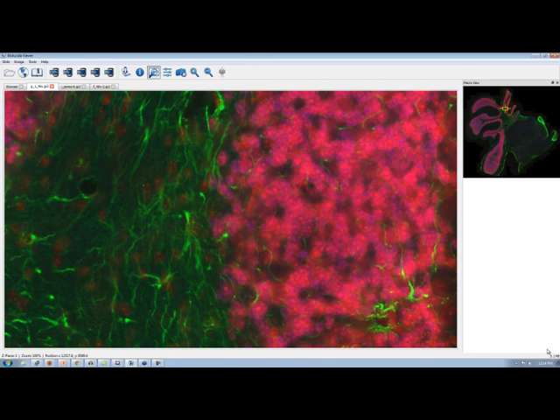Sure. Now this image itself is a 2D virtual slide. It's about 30,000 pixels wide by 30,000 pixels tall, and we're navigating around pretty quickly for it. Yeah, absolutely. Compare this to a standard single image capture. Most cameras capture between 1 and 2,000 pixels in dimension. Compared to that, yeah, this is huge. This is a much larger image.